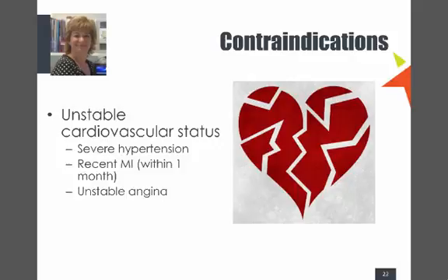So your patients really need to be stable, unless, of course, you're trying to assess the severity of an asthma attack. And that is a gold standard spirometry. For that, we'll talk about that in a bit. If someone can't do spirometry, they should be going to hospital.